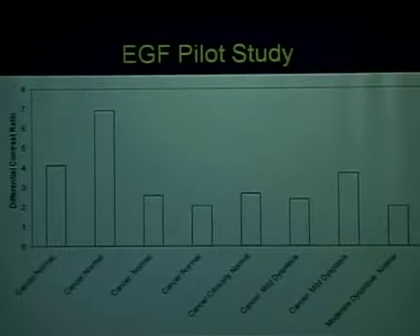Our dye in this case was Alexafluor 647. And so we're exciting around 630 and looking at the fluorescence around 650. In this case, there's very little difference in the autofluorescence, and so all of our contrast is coming because of the increased uptake of the dye. And you can see it's not as high. It ranges from 2 to 7 in this case. So taking advantage of that autofluorescence, it can increase your differential contrast significantly.